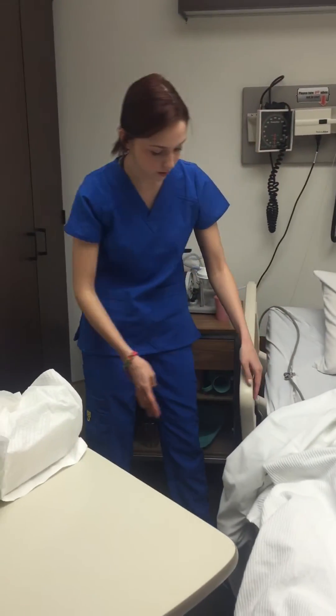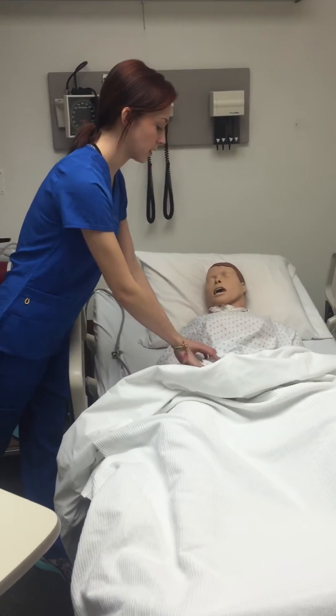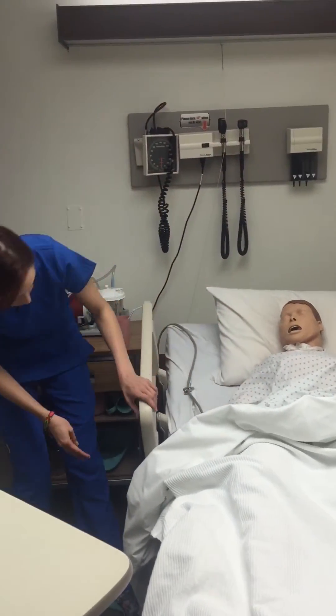I would then tell her what I'll be doing and I would ask her if she has any tenderness. I would feel and push on her bladder, and then I'm going to raise the bed.